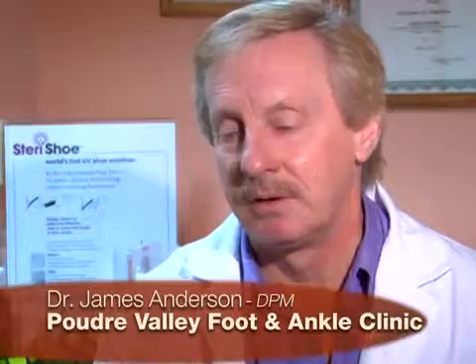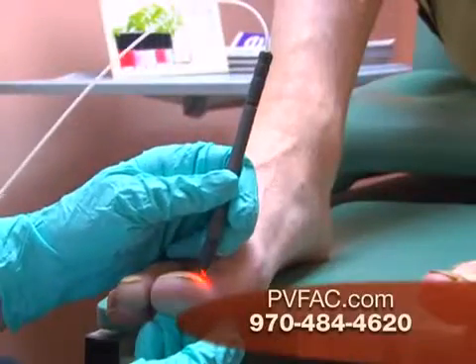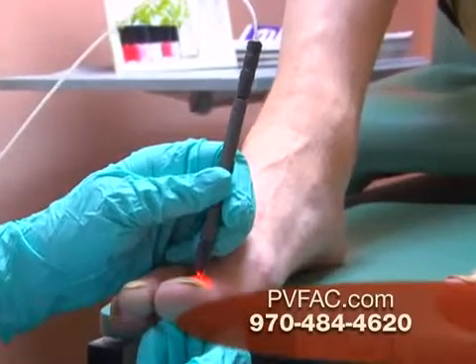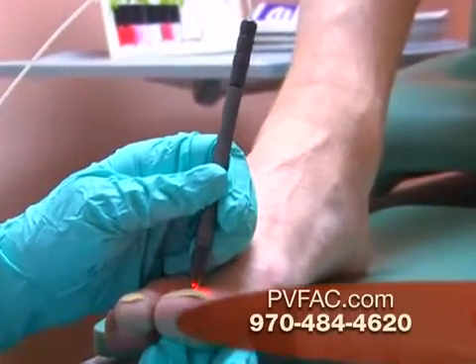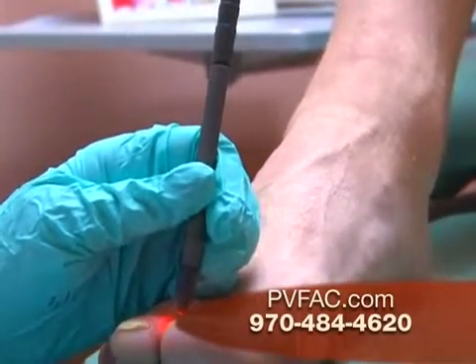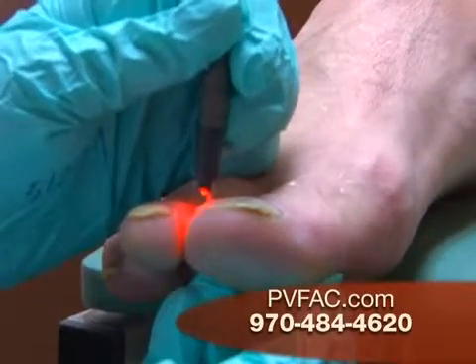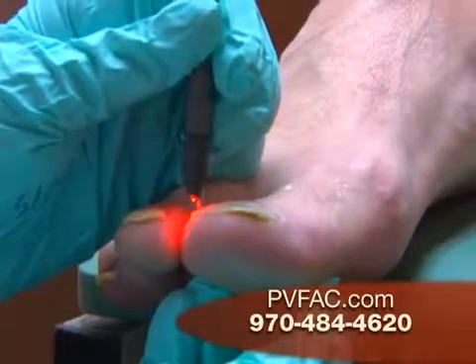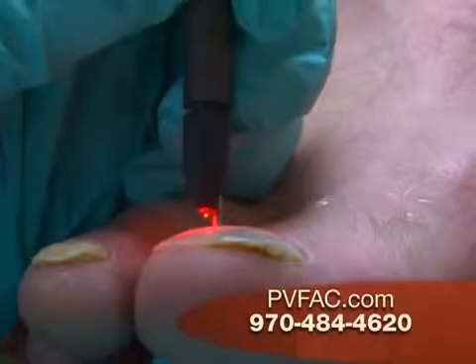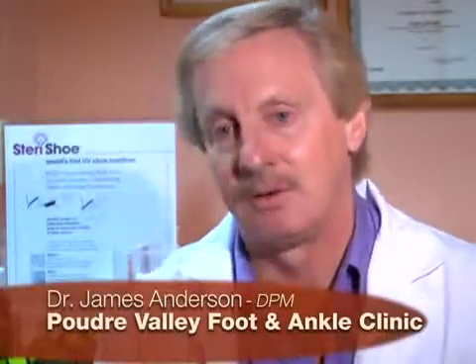Then once that's done, we go in a grid manner on each of the nails, at 90 degrees to each other, with the technician doing that. And we do all the nails. That's important for the viewers to understand. If you have 2 nails or 3 nails or 4 that have fungus, we're going to do all 10. The reason for that is we found out early on, here and out in California where this first started, that if you don't do all the nails, sometimes the clean nails, maybe a year later, will get fungus on them, and then you'd have to come back and do more treatments. So we want to get a clean slate all at once, doing all 10 nails when you come in.